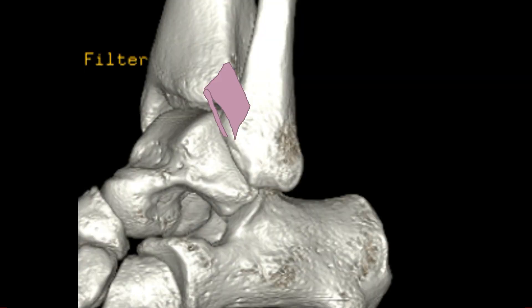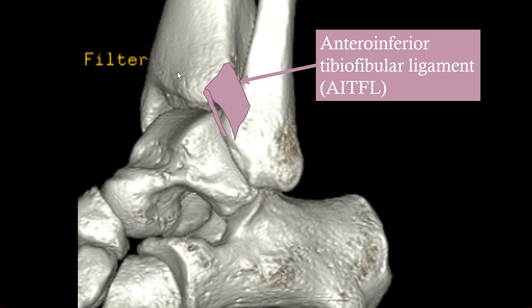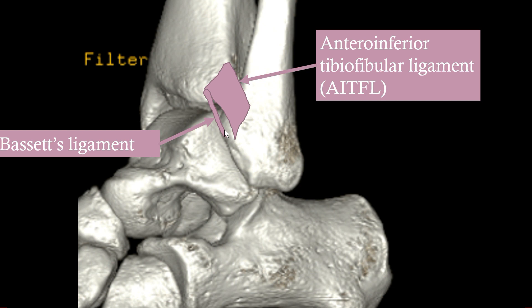The syndesmosis of the distal tibiofibular joint consists of three different parts: an anterior one, a posterior one, and a middle one. Starting with the anterior one: we have the anterior inferior tibiofibular ligament, abbreviated AITFL — not to be confused with ATFL, which is the anterior talofibular ligament. Sometimes there is a thicker ligament more distally, and this is known as Bassett's ligament.